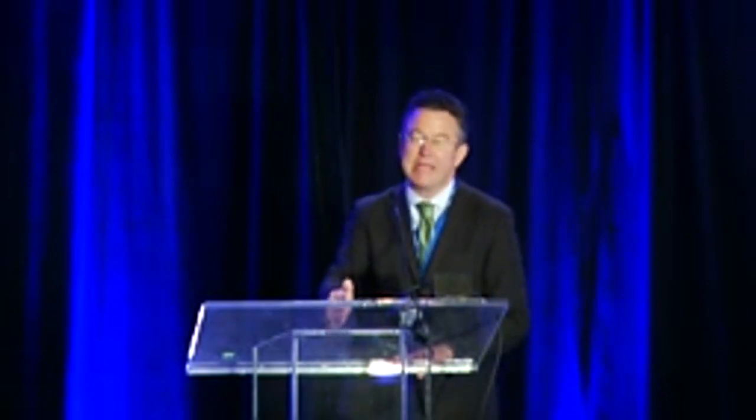If you have the monitor in your patient, though, you don't have to guess, and you don't have to generalize. You can just look exactly at what's happening to Mr. Jones this Friday afternoon. And what he's doing this Friday afternoon may be different from what he's doing tomorrow. So it's a totally different level.